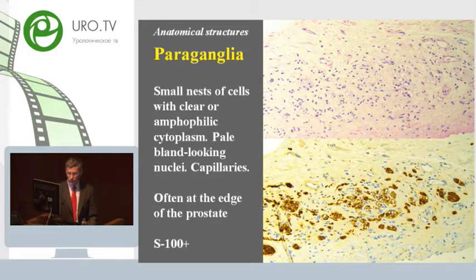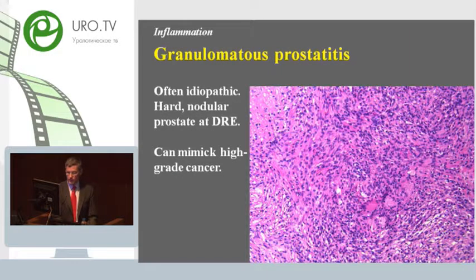In the interest of time, I will skip a couple of cases here and move on to granulomatous prostatitis, which may produce a hard nodular prostate at palpation, so you think it is cancer, but this is benign. These are multinucleated giant cells. This is often idiopathic, probably because some glands have become disrupted and secretions have caused this reaction.